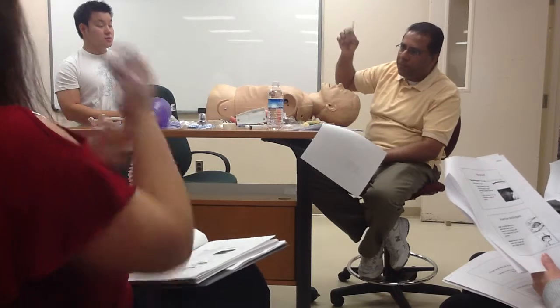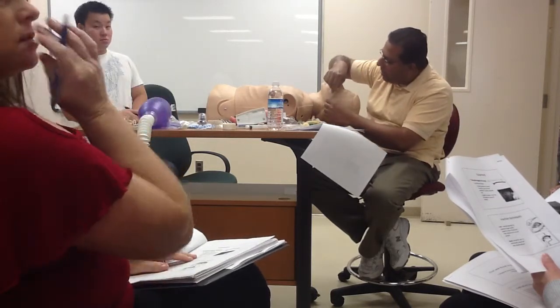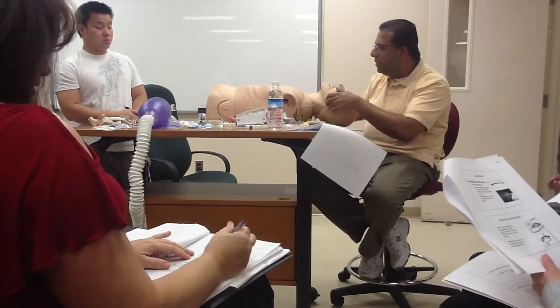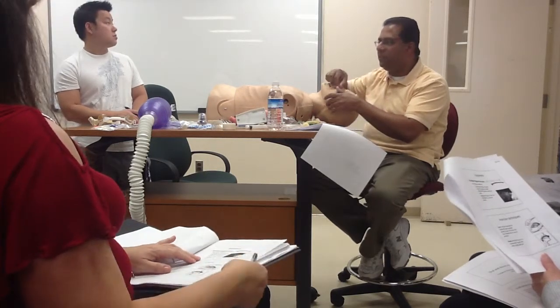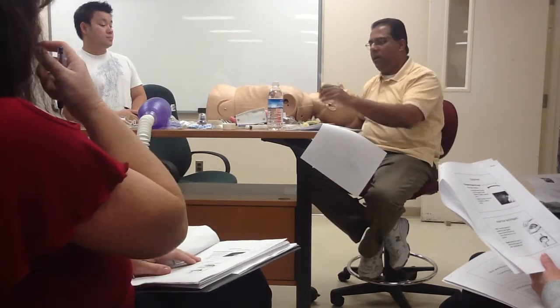Well, I'm talking about measuring the tip of the earlobe to the nostril. Are you talking about the tip of the nose? Watch me. Tip of the earlobe to the nostril. The middle, or just the side? The length of the airway is from the tip of the earlobe to the center of the nostril. Okay, so this is actually too small. It's gotta be to the center.